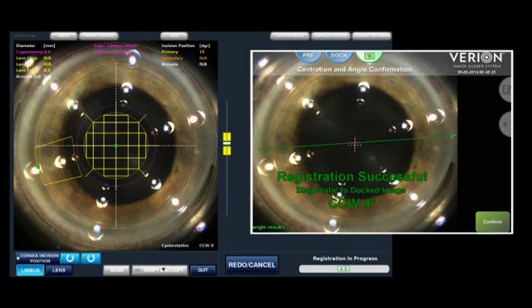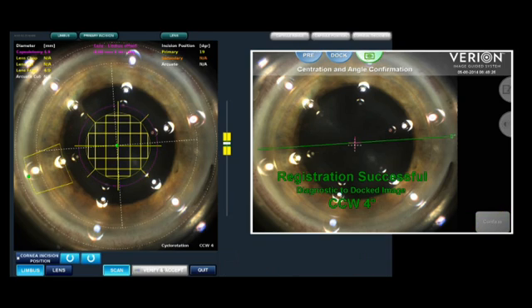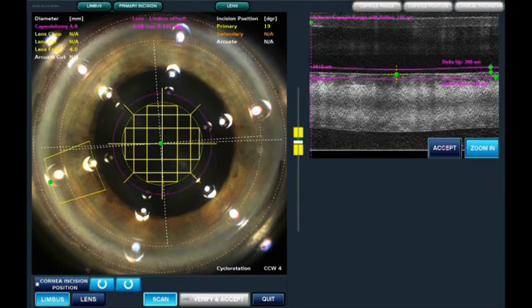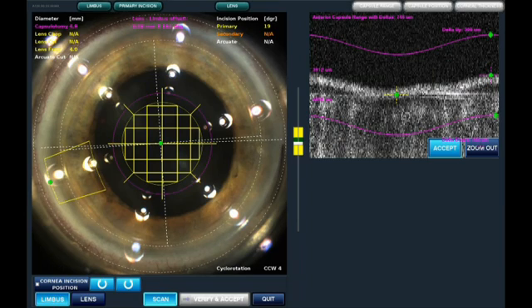We have already taken a high-definition picture of this eye, which identifies various structures on the iris as well as the limbal vessels, and we will use that to orient the lens. You can see the VERION automatically centered the capsulotomy within the pupil and also placed the incision automatically at the limbus. I have found that the VERION is much better at this than I am doing it manually.